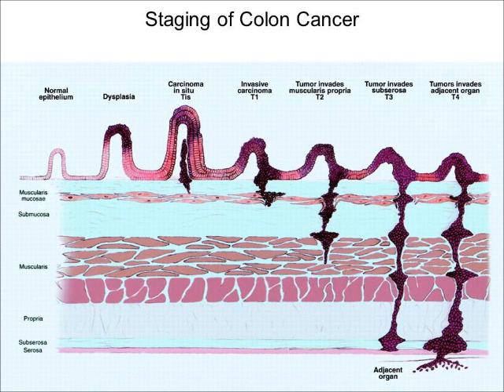In this laboratory, you will be asked to stage some of the tumors. Now, in colon cancer, staging is considered to be far more important than grading for determining the prognosis and treatment. Remember, an important aspect of staging is the extent or spread of the tumor cells. Staging of colon cancer depends on whether the tumor cells have passed certain landmarks in the wall of the colon, and this must be evaluated under the microscope. This figure shows part of the TNM system for staging cancers, and it is the T part of this system, the spread of the primary tumor, that we will be concerned with here.